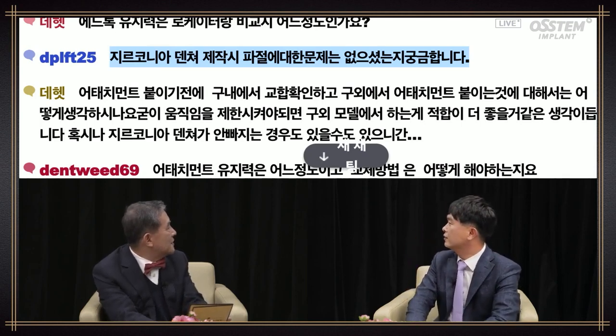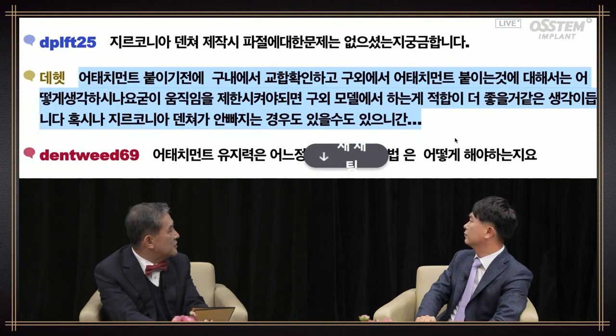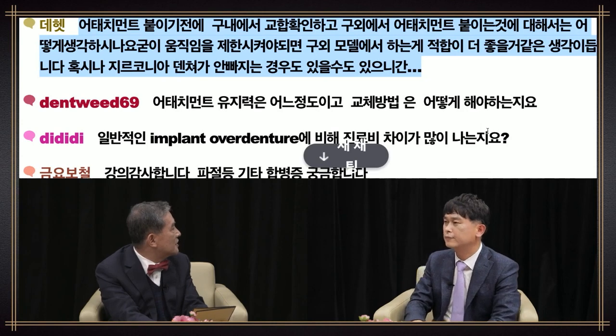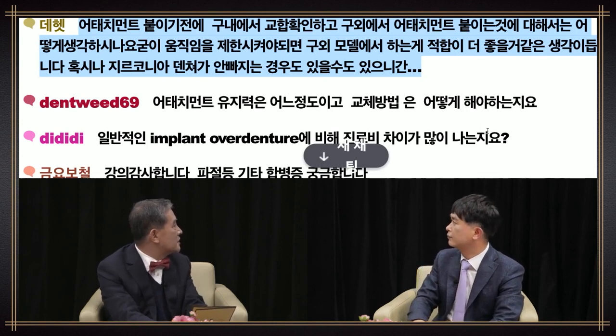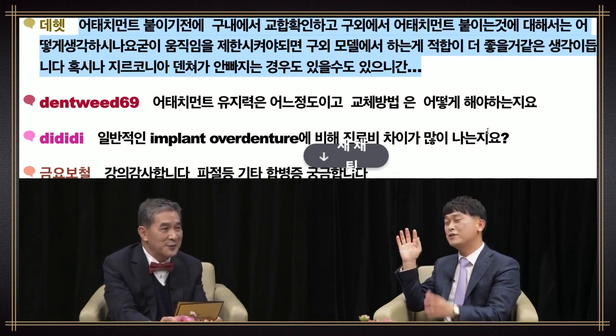Someone asks, what do you think of checking occlusion in the mouth and attaching the attachment extraorally? If you need to restrict the movement, fitting it extraorally would be more appropriate, as a zirconia denture may not be taken out. That's really a very good question.